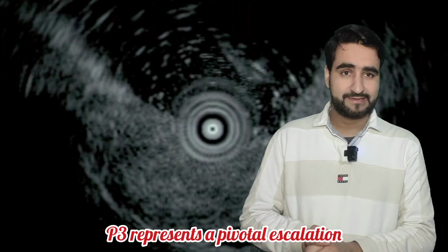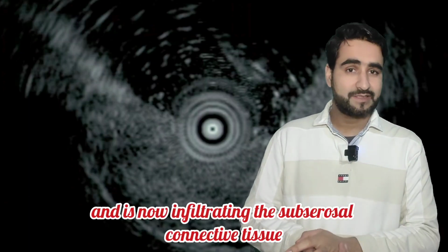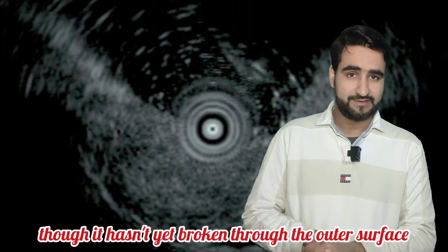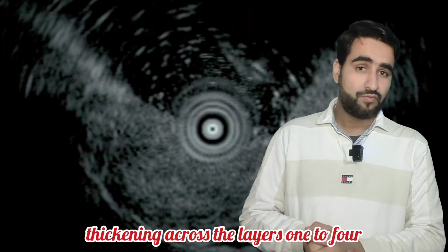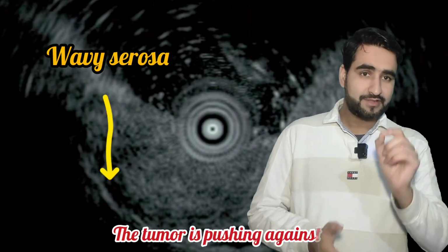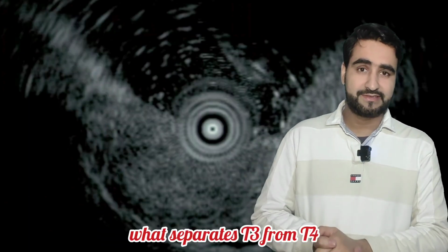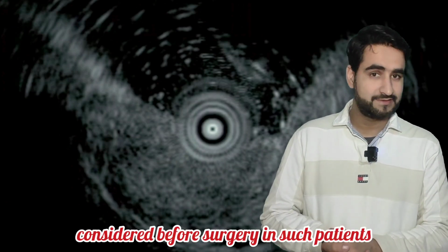T3 represents a pivotal escalation. The tumor has pushed through the muscularis propria and is now infiltrating the subserosal connective tissue, though it hasn't yet broken through the outer surface. What you see is a heterogeneous, irregular thickening across layers 1 to 4. Wall architecture is severely distorted. The critical finding here is that the fifth layer, the serosa, is still visible but appears irregular and wavy. The tumor is pushing against it, not yet through it. This subtle finding is what separates T3 from T4. Neoadjuvant chemotherapy should be strongly considered before surgery in such patients.